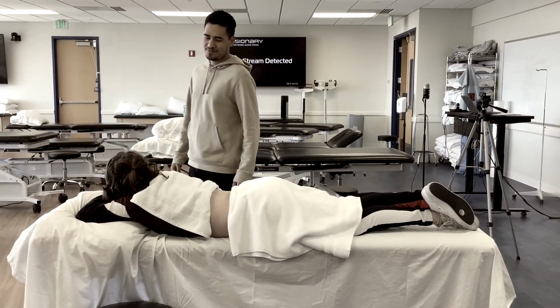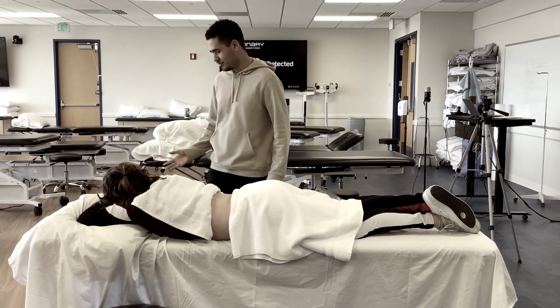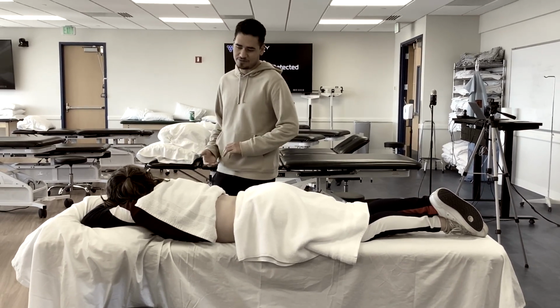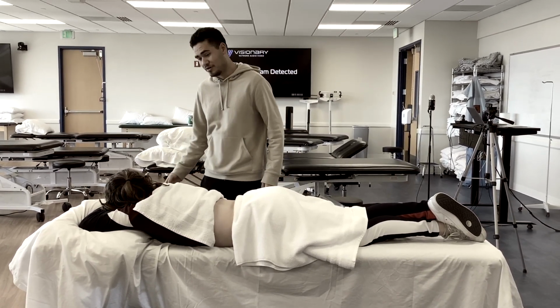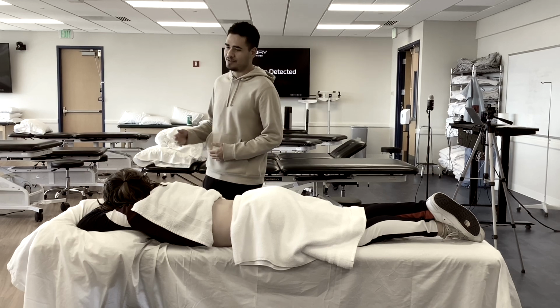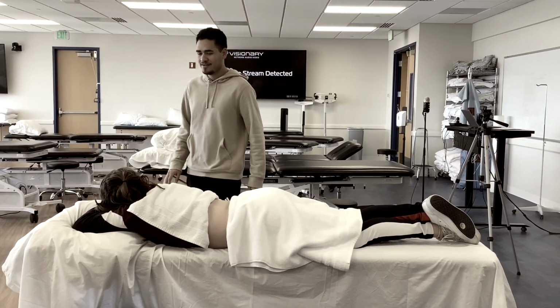Hi Bonnie, how are you today? Good, how are you? I'm good. So today what I want to try is some ultrasound. That's where we send sound waves into your body, and that's going to help the healing process. With this ultrasound, we'll also get some heat in that area, which will help the healing process even more. So would you be open to trying ultrasound today? Yeah, absolutely. All right, perfect.